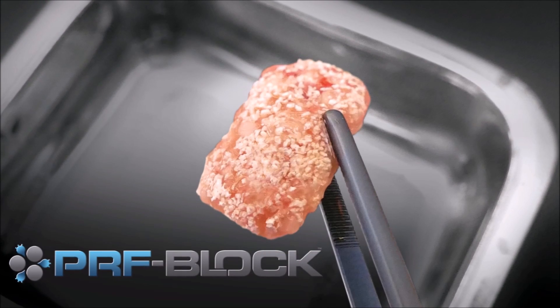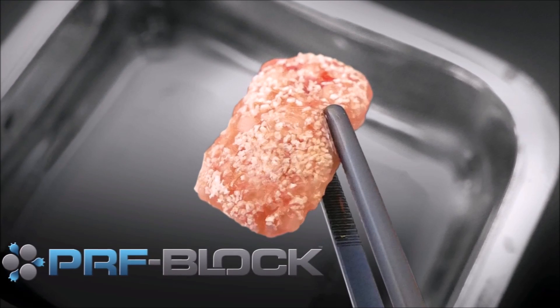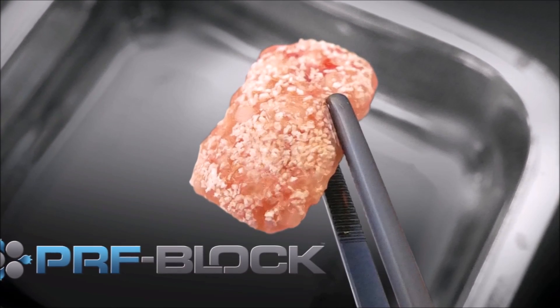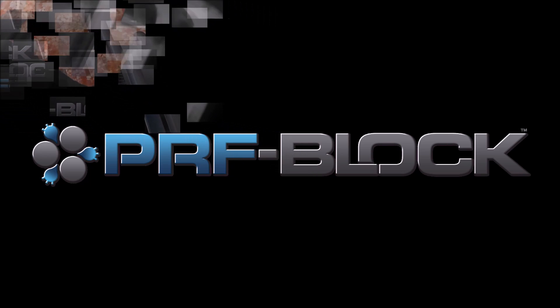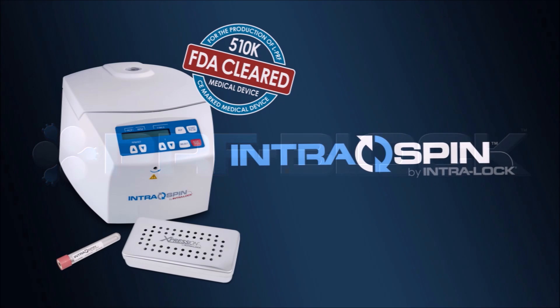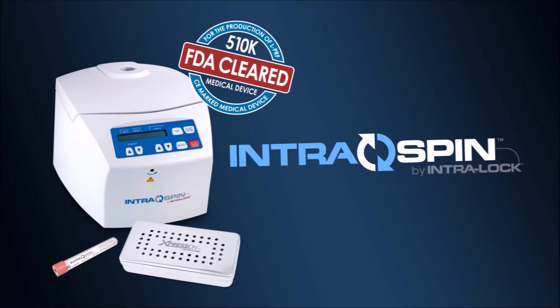The result is a PRF block, which is dense, durable, and can be held in place by bone screws. PRF block — another innovation from the leader in autologous biologics.